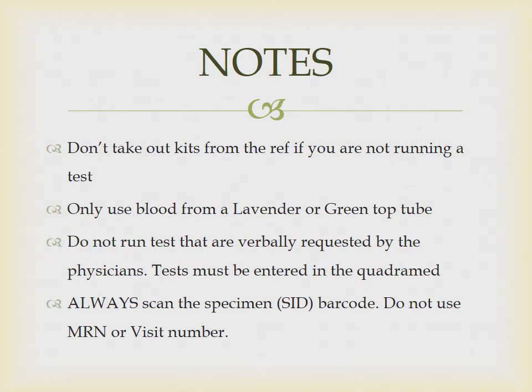Remember, do not take kits out of the refrigerator if you are not running a test. Only use blood from a lavender or green top tube. Do not run tests that are verbally requested by the physicians. Tests must be entered in the system. Always scan the specimen barcode. Do not use MRN or visit number.